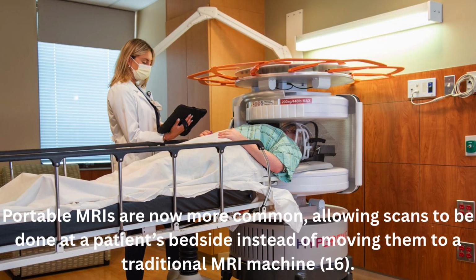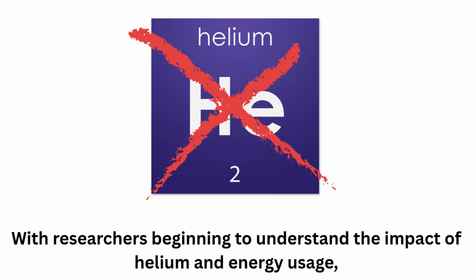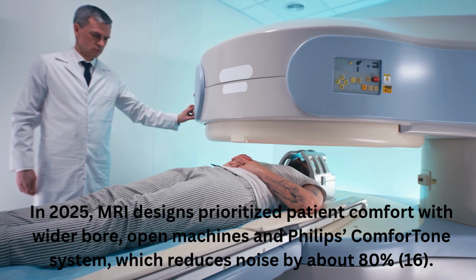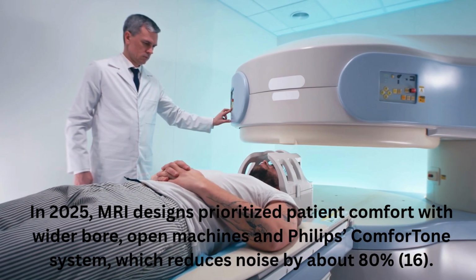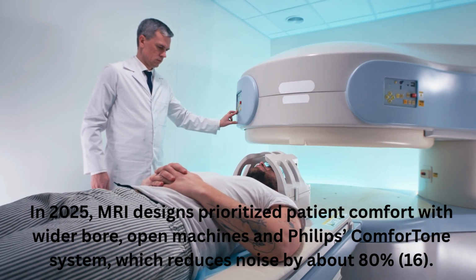Portable MRIs are now more common, allowing scans to be done at a patient's bedside instead of moving them to a traditional MRI machine. With researchers beginning to understand the impact of helium and energy usage, manufacturers are making an effort to reduce their environmental impact, and designs that are helium-free and energy efficient are being produced. In 2025, MRI designs prioritize patient comfort with wider bore or open MRI machines and Philips Comfortone system, which reduces noise by about 80%.